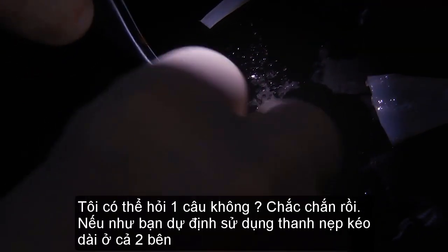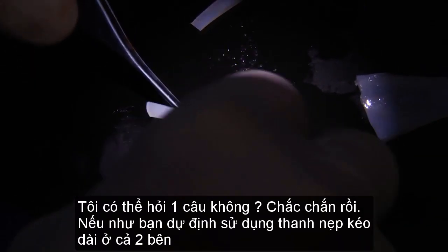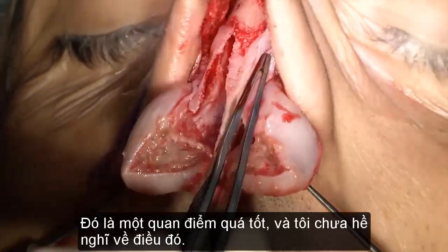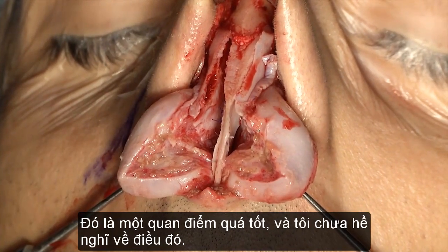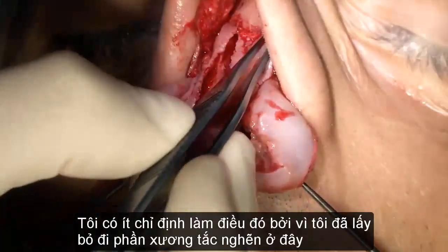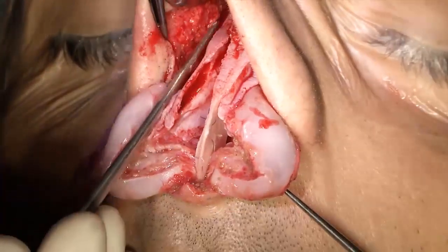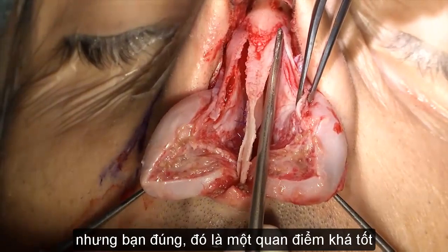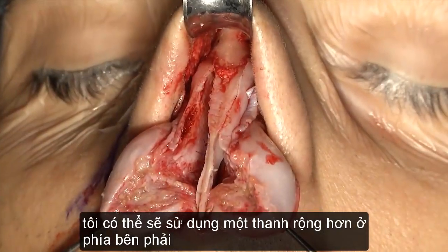See? Dr. Raboti, can I ask a question? You sure can. If you are planning to use bilateral spreaders, are you contemplating to keep the right one bigger than the left because of the initial deviation? That's a good point, and you know I hadn't thought of that. I may have less of an indication for that since I did take out some of the bone here. But you are right. That's a good point. I will probably use a little wider one to the right side.